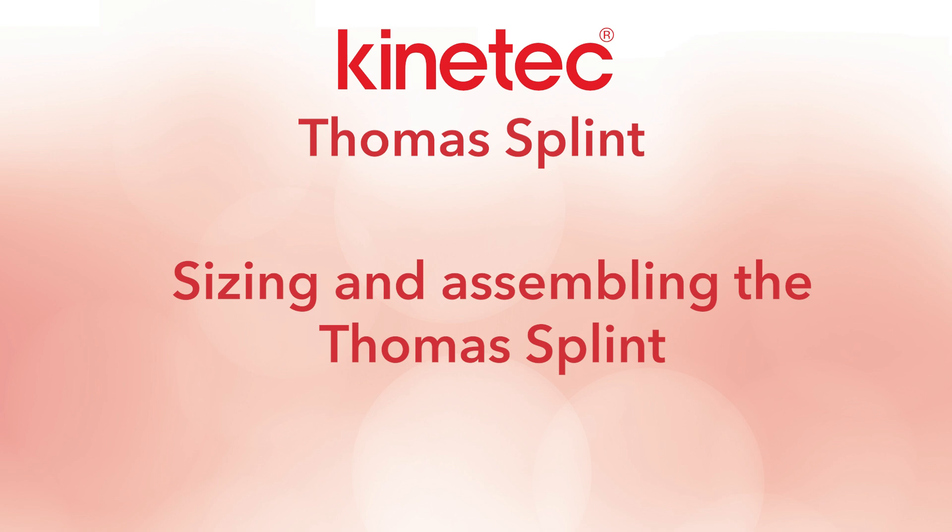In this tutorial, we will guide you through the process of sizing and assembling a Thomas splint.